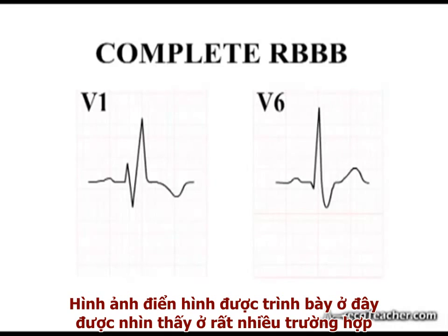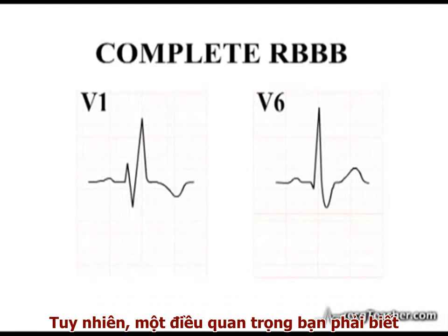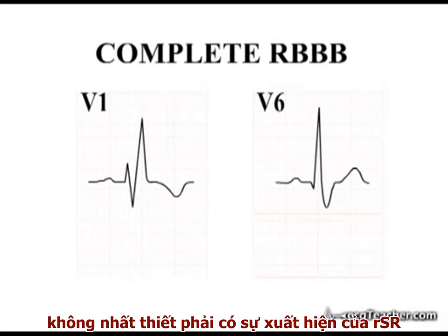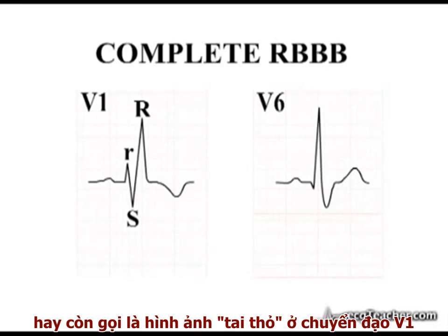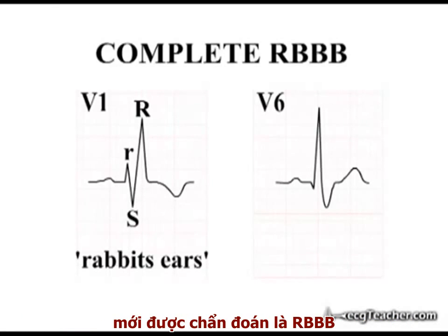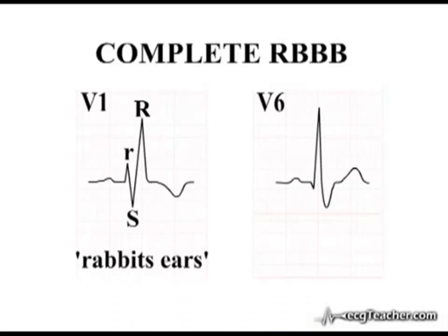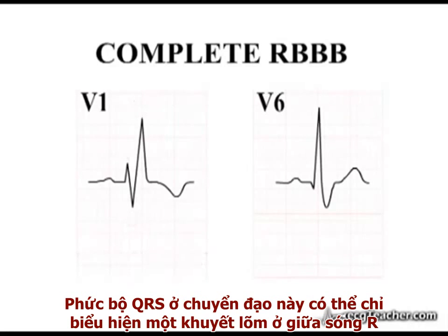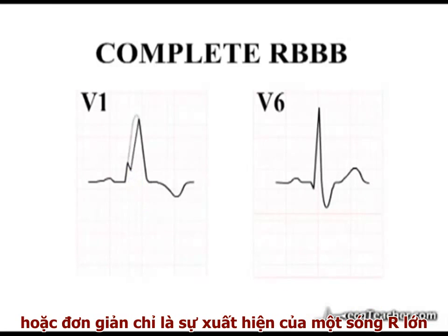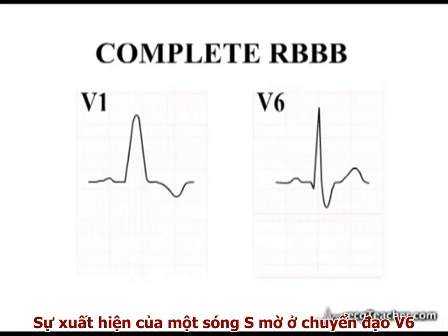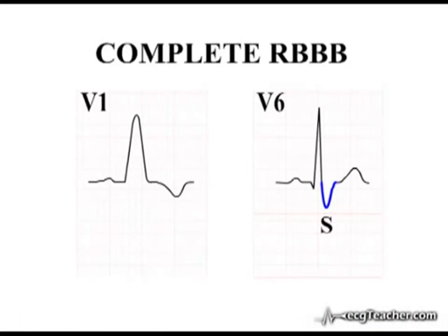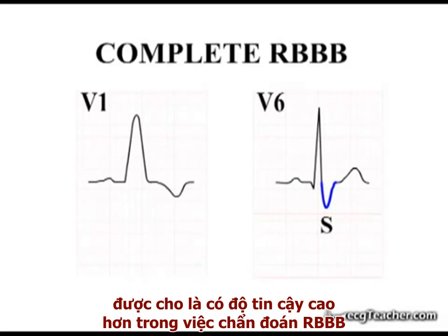The classic RSR pattern is seen in many cases. However, it is important not to become over-reliant on the presence of the RSR pattern, or so-called rabbit's ears appearance in V1, to make the diagnosis. In many cases of right bundle branch block, the RSR pattern in V1 is not identifiable, with the QRS complex either demonstrating a small notch between the two R waves or having the appearance of one large R wave. The presence of a slurred S wave in lead V6 is said to be more reliable in the diagnosis of right bundle branch block.